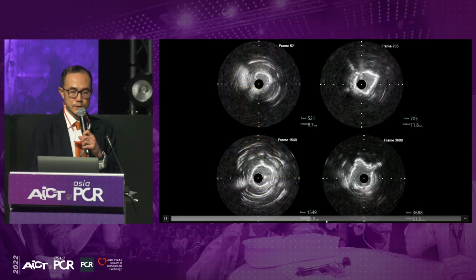So that was also another consideration why we did not upsize the burr, and we proceeded instead to just using a balloon angioplasty. We were also in line with Dr. Guaning to decide to use intravascular lithotripsy. And we'll show you what we did next. Okay, so we proceeded to intravascular lithotripsy.